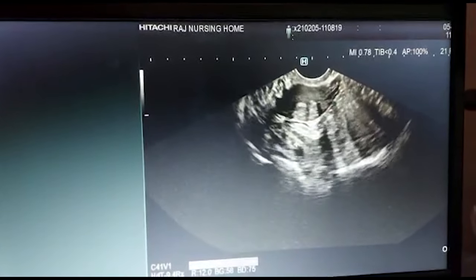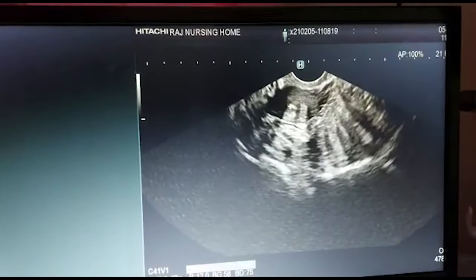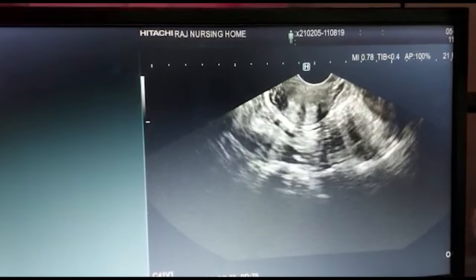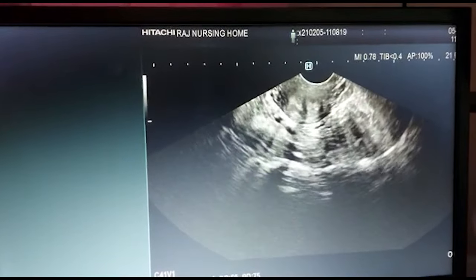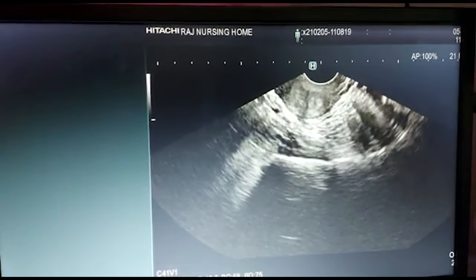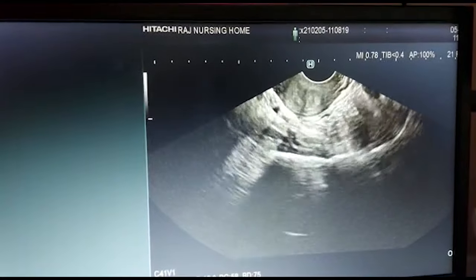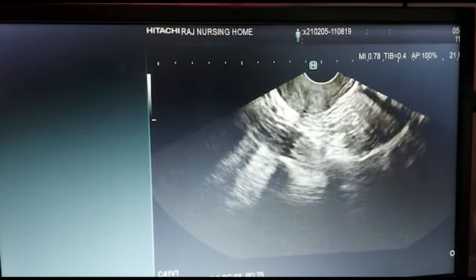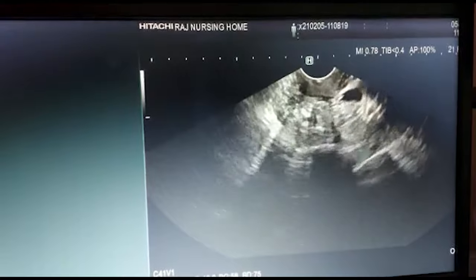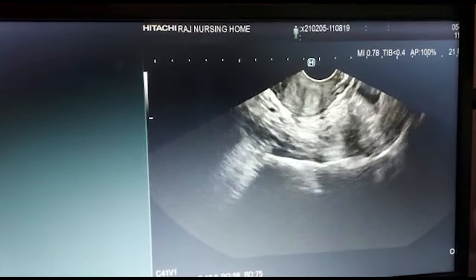I reach the cervix, and I can see two dots here. Coming down further, I can see two vaginas — one here, one here. The septa is dividing the vagina. This is the lowermost portion where the vagina appears single.